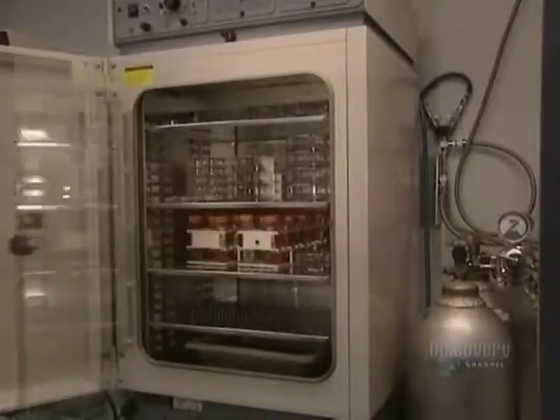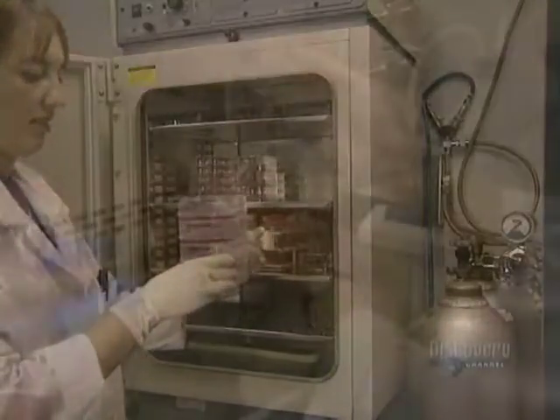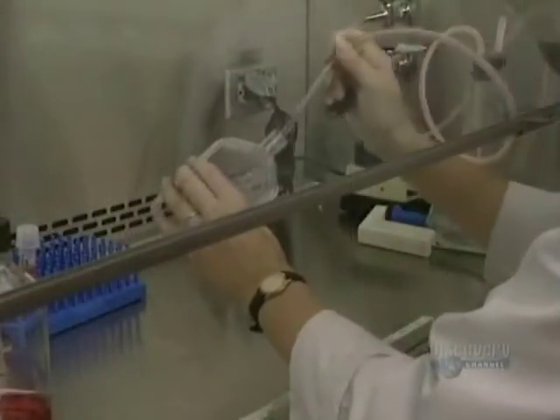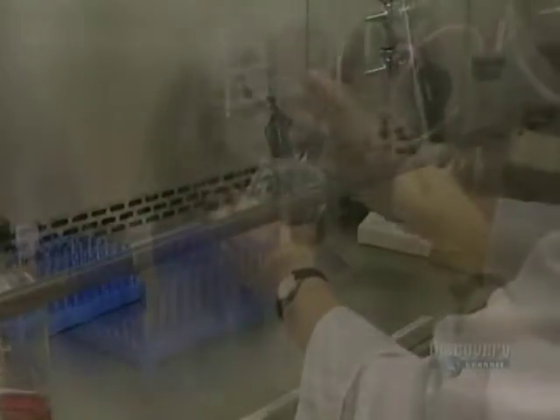In less than a week, the cells have almost covered the entire surface of the flask. They can now be trypsinated anew and thus reseed some 50 flasks, which in turn will be placed in the oven for about one week.